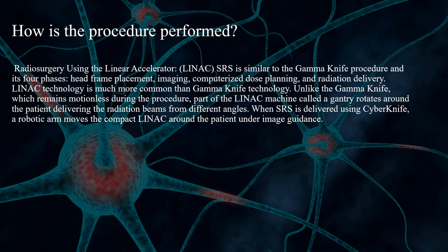Radiosurgery using the linear accelerator. SRS is similar to the gamma knife procedure and has its 4 phases: head frame placement, imaging, computerized dose planning, and radiation delivery. LINAC technology is much more common than gamma knife technology. Unlike the gamma knife, which remains motionless during the procedure, part of the LINAC machine, called a gantry, rotates around the patient, delivering the radiation beams from different angles. When SRS is delivered using CyberKnife, a robotic arm moves the compact LINAC around the patient under image guidance.